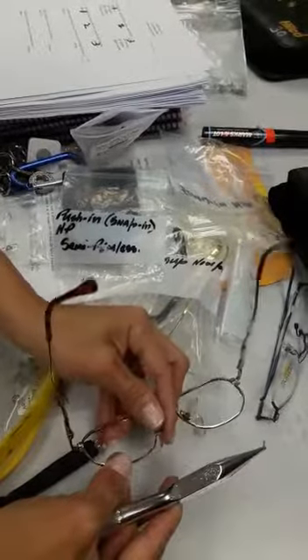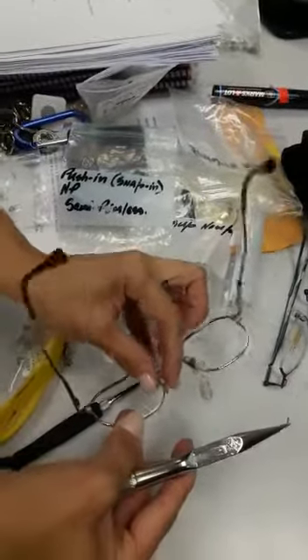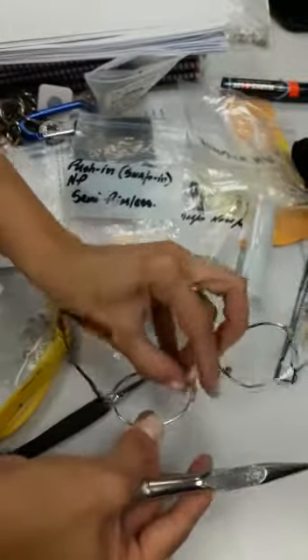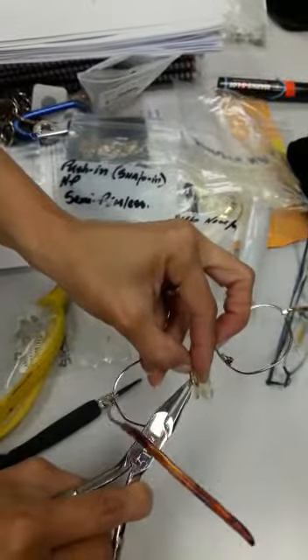So, to put it back, again, you put it right in the little hole of the nose pad, the guard arm. And you line it up.